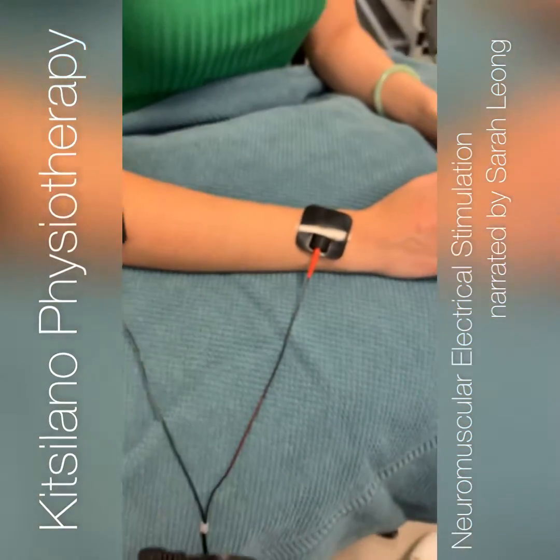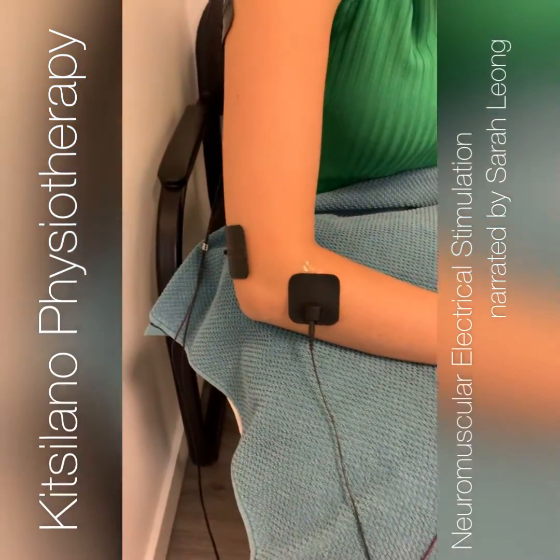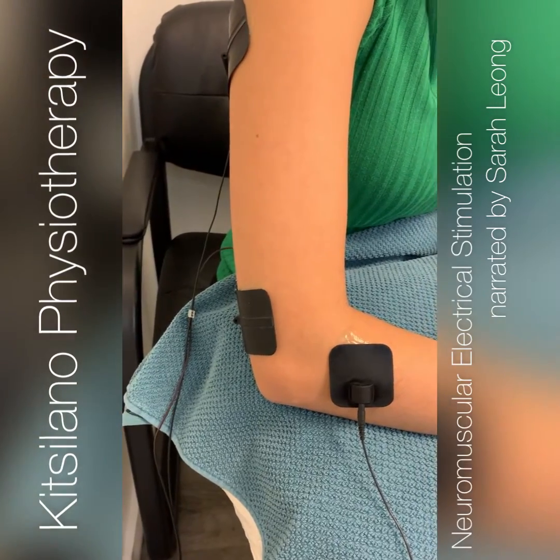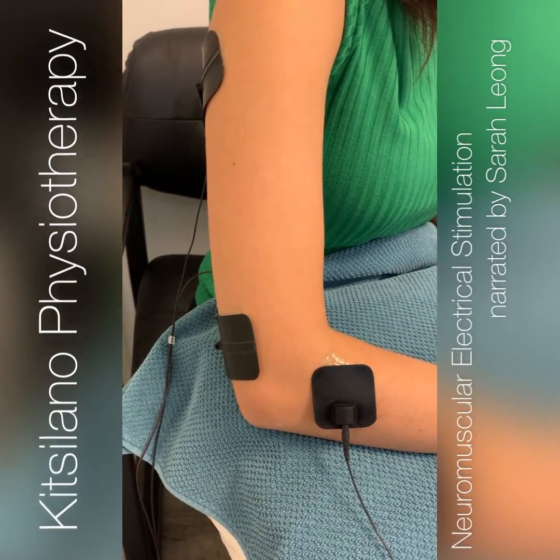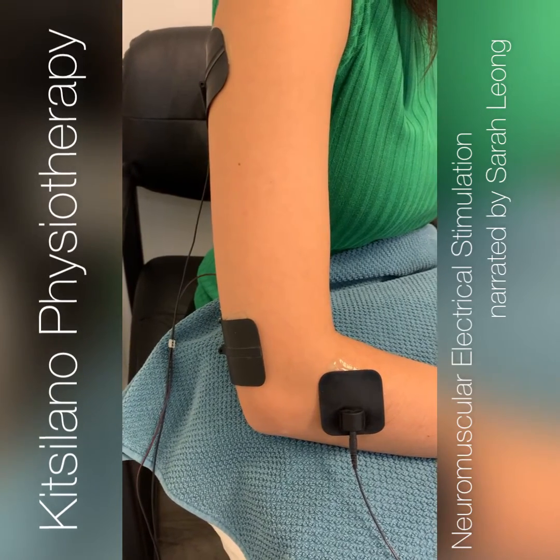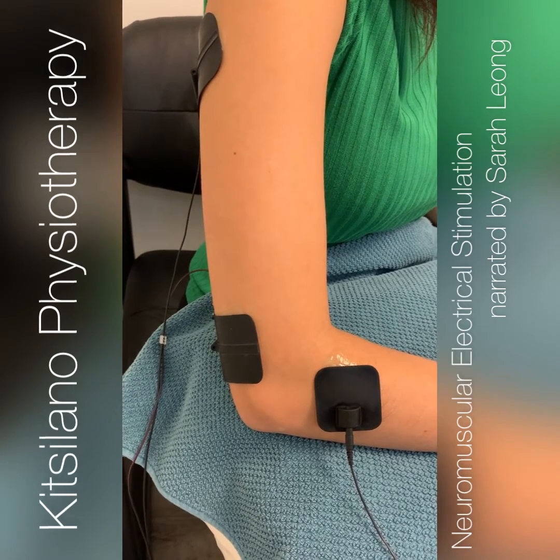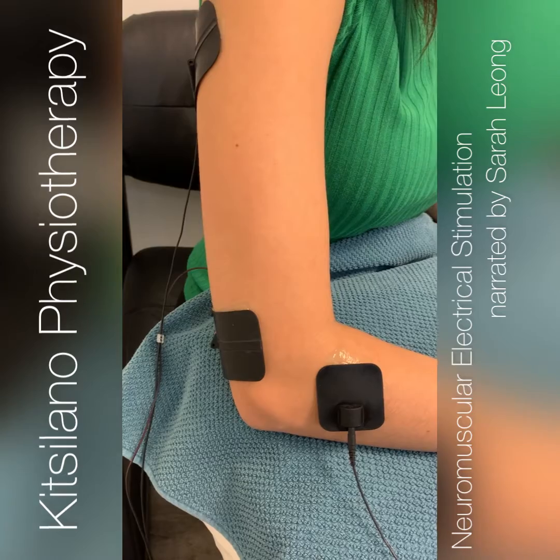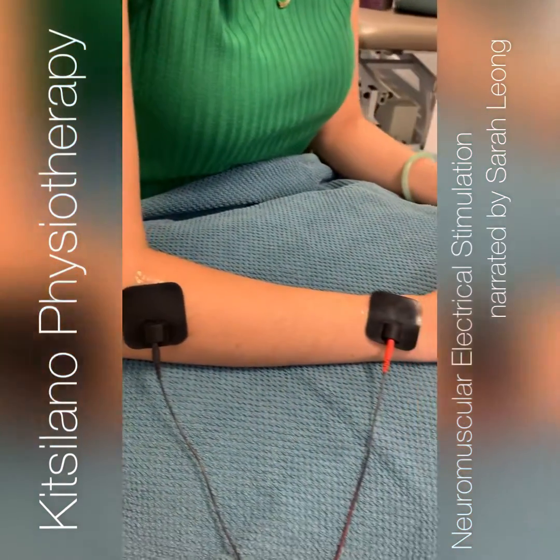I'm turning up the current so you'll start to see activation. The triceps are going to be a little bit more subtle, but you can hear me turning up the activation, and our model here is going to let us know when she starts to feel the muscle activate. You might feel a little bit of tingling, then it should feel like twitching, and then you can see her muscles start to activate. If it's strong but comfortable, then we're good.